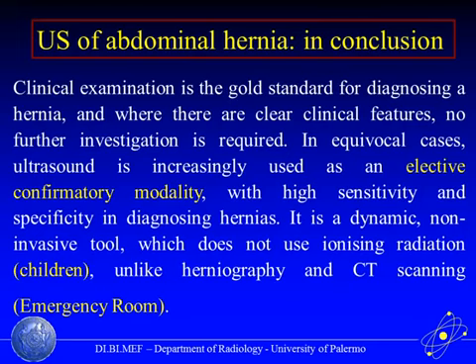And unlike herniography and CT scanning. Of course, CT scanning remains a useful tool in the ER department in order to evaluate emergencies and complications of abdominal wall hernia.